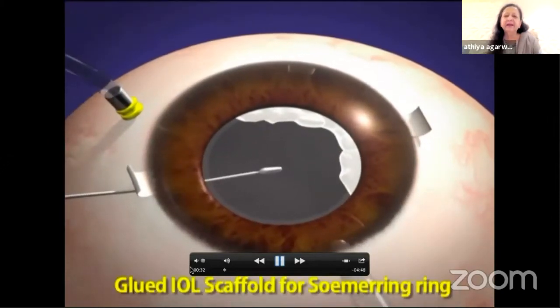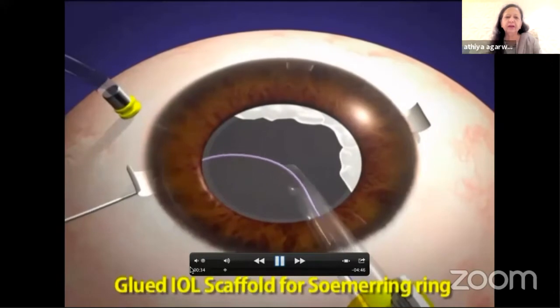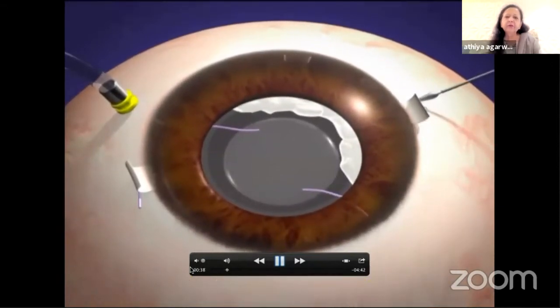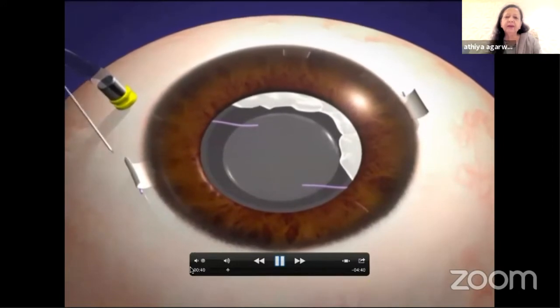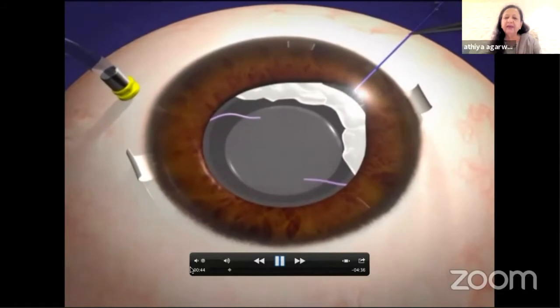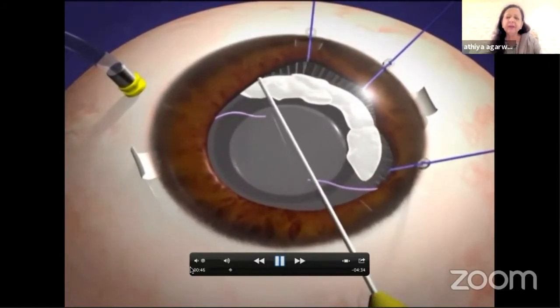You saw me creating scleral flaps. Then you saw the fluid inside the eye. Then I took a glued IOL, making a 2.8 millimeter incision. And this is before I could even take out the Sommering ring.